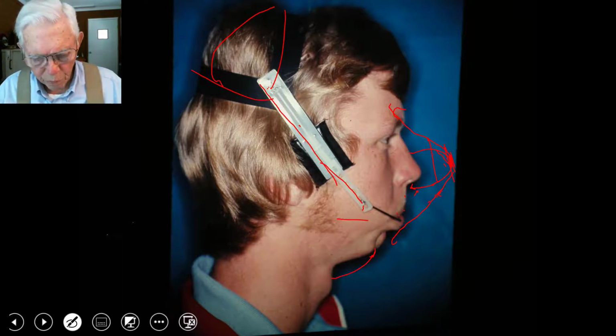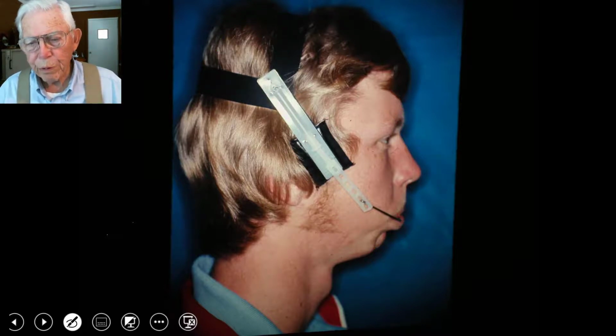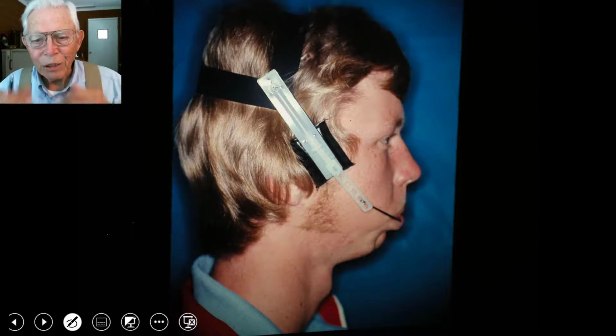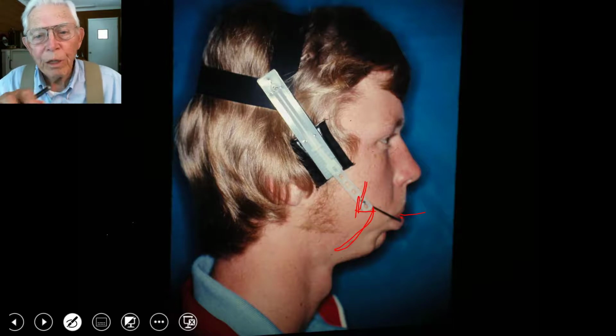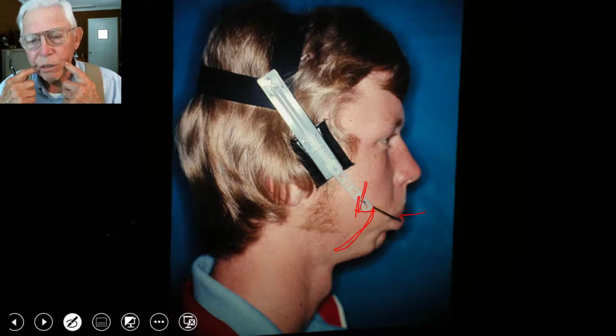Now today we know a lot more about it. We put blocks on these back teeth, back in here. And then the guy chews whatever he chews, he'll chew with about 2 or 3 times as much force on that, and he will depress these teeth back in here and keep much of this from happening. And if you want to lower the angle of a case, you can remove some teeth and get it to go down.